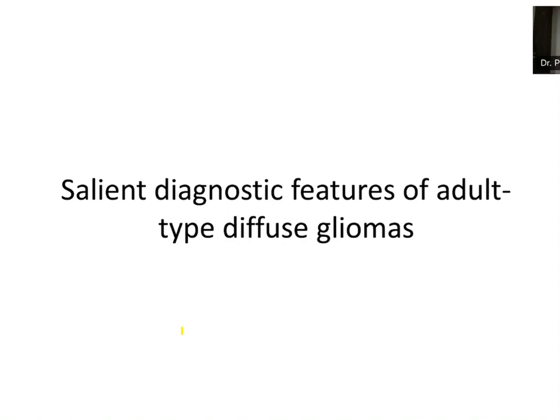Any other relevant questions? Is there any cutoff percentage of cells that need to stain to call it P53 mutated? My suggestion would be to never report anything on IHC simply as P53 mutant. There are two ways of reporting it. You can express what percentage of tumor cells are showing intense, strong positivity. As per the literature, anything more than 10% of tumor cells showing strong intensity positivity can harbor a P53 mutation. It may not be 100%, but anything more than 10% strong positive cells is significant.